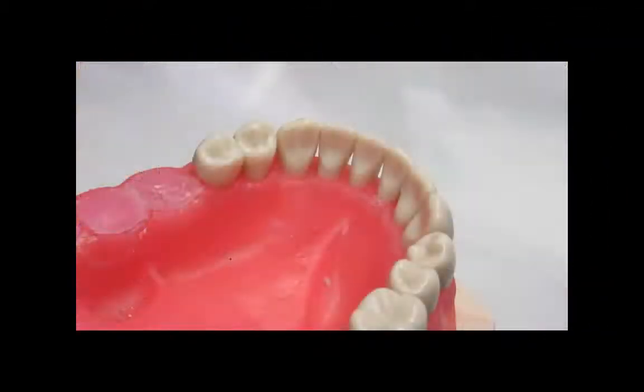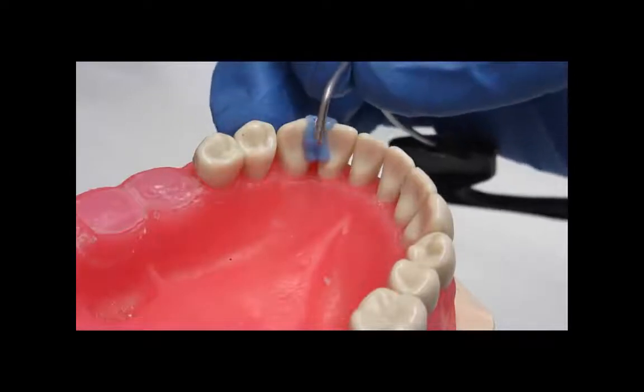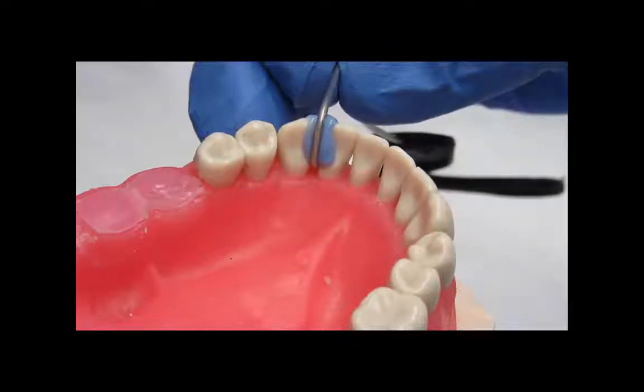I can now connect the wire to the tooth or teeth. I start with applying a thin continuous layer of material onto the lingual and incisal surfaces of the selected anchoring incisor. It can be convenient to use 2 teeth crowns and to place the wire just over the embrasure area. I now place the bent 6 mm part of the wire in the composite material, so it comes in contact with the lingual side of the teeth, while aligned in parallel with the tooth length axis, with the rest of the wire crossing over the incisal edge, or the embrasure in this case.